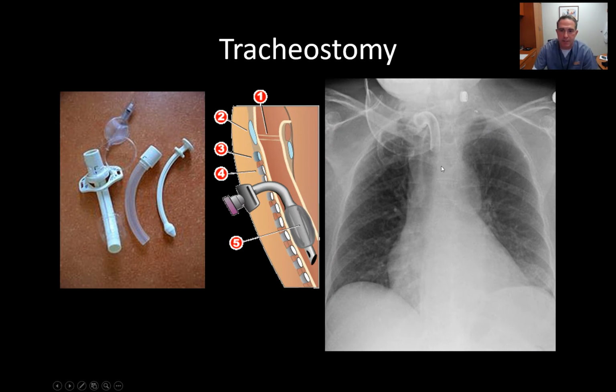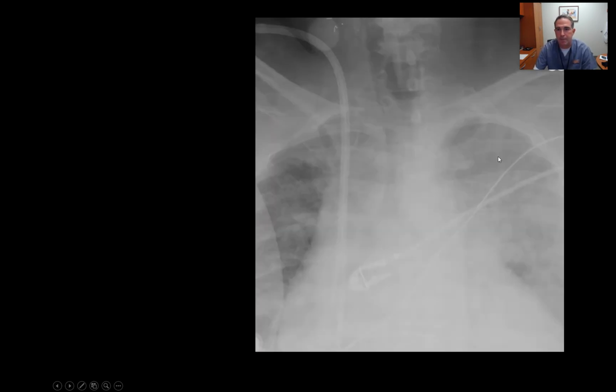So a typical tracheostomy tube, I've never particularly seen one or called one to be in the wrong position, but there's one where we'd expect to see it. This is a film where you see the outline of the trachea, and then we have this gas lucency adjacent to the trachea. It says patient in the ED intubated.